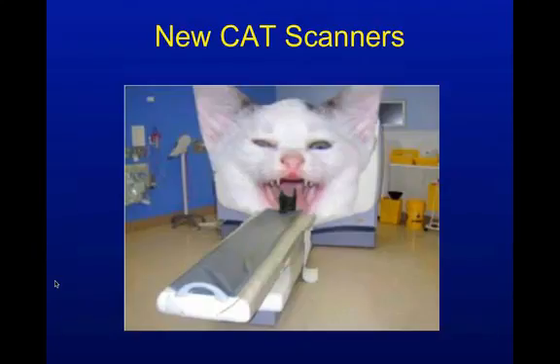We now have newer CT scanners that are very high resolution, super duper fast. I mean, these 640 slice CT scanners that have the fixed array, multiple targeting places with the electron beam that's zipping around as you just do a helical scan, and basically can do a CT scan of the beating heart within 1 second and take a look at the coronary artery bypass grafts to see if they're patent as you're watching the flow move through that vessel. It's incredible, the resolution of that stuff. So, but someone's got to read the scan, and I like looking at all my own CT scans.